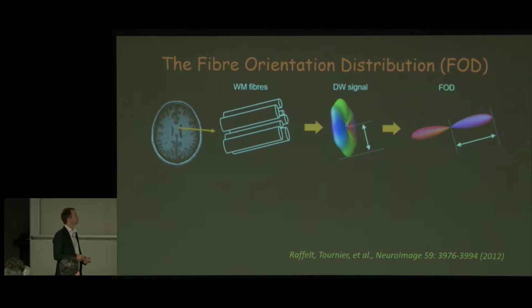And the great thing is, because it's a linear operation, you know that the signal scales with the amplitude of this thing. So the greater the signal in the radial plane here, the larger the amplitude of the fiber orientation distribution. Yes? Sorry, what is the max number of directions that you can deconvolve in? It's a distribution. There's no set maximum. You just get the distribution.